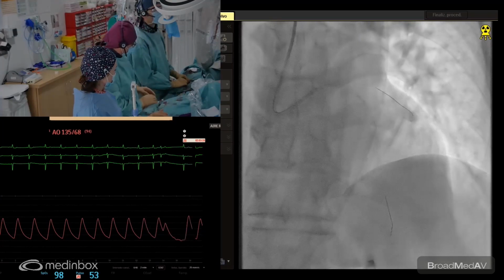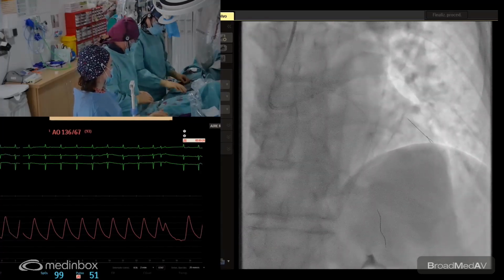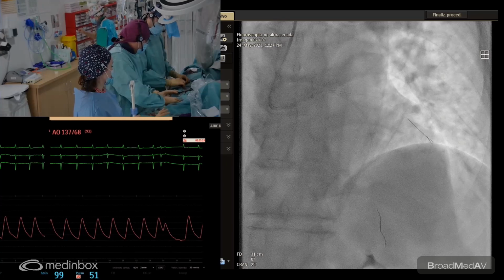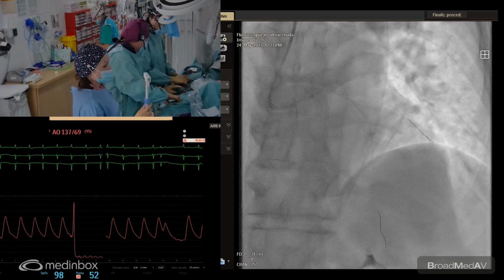Okay, you have the... I don't know if this is the diagonal, sorry. No. Pido eso. Sí. Ok, píllala, por favor.